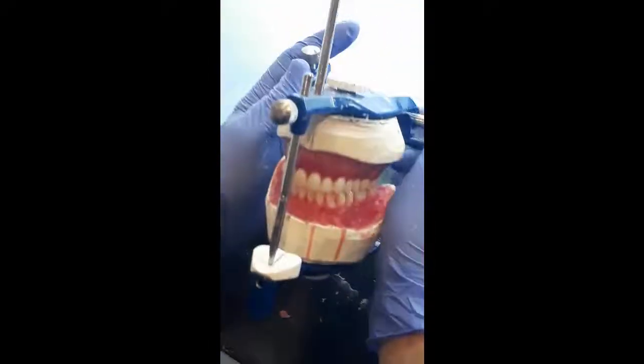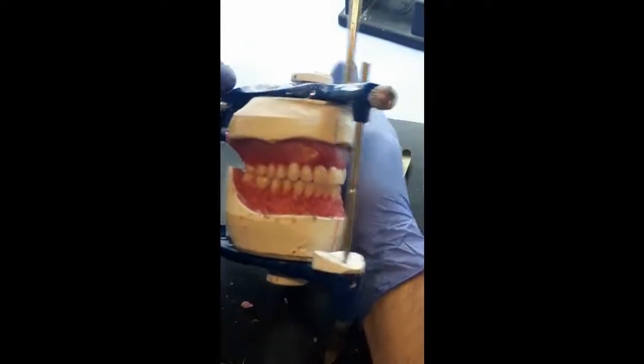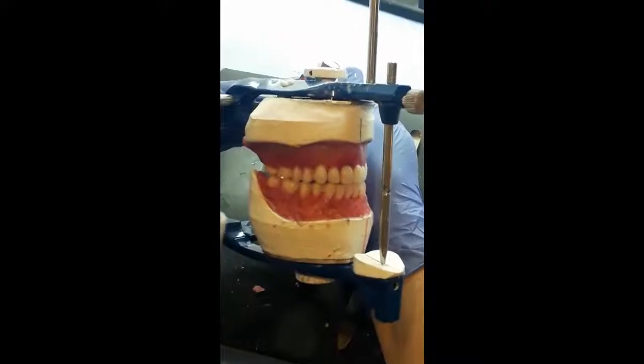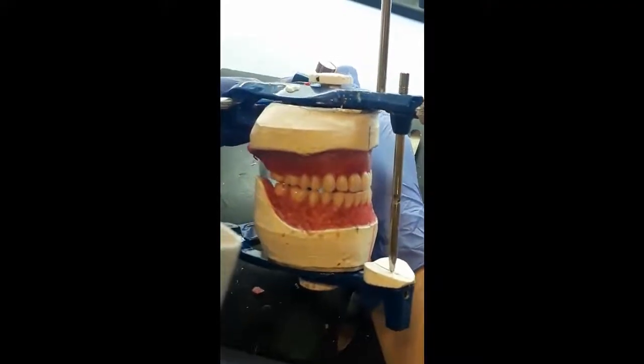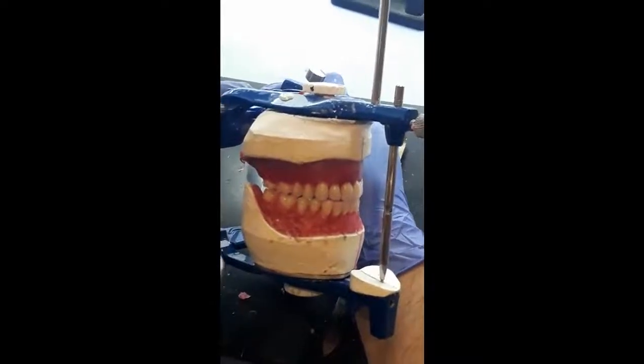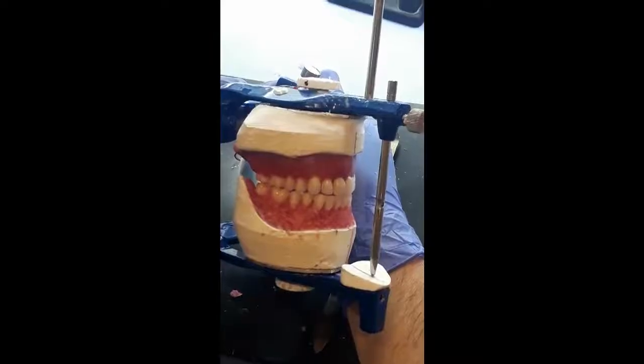Now we evaluate the balancing contact in the protrusive movement on the right side. You can see here that I can achieve edge to edge without separation, and I have multiple balancing contacts in the posterior teeth.